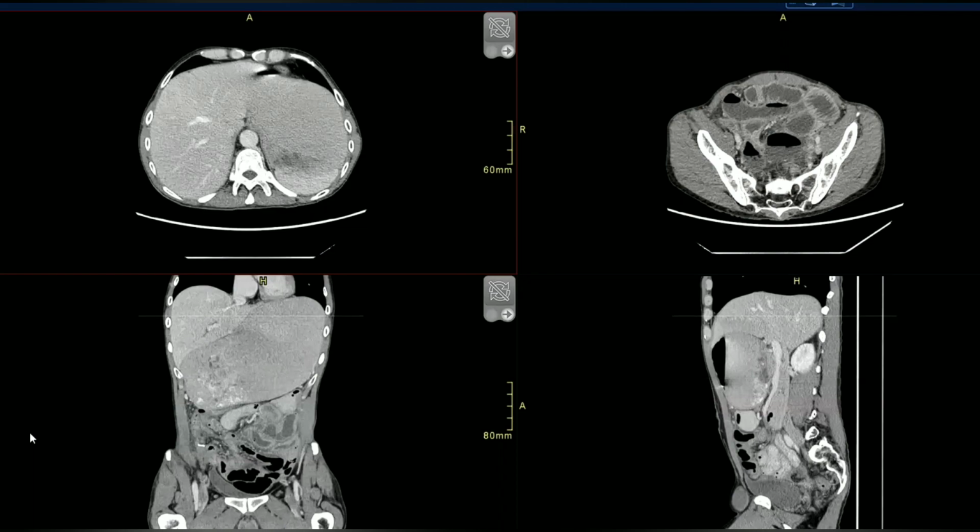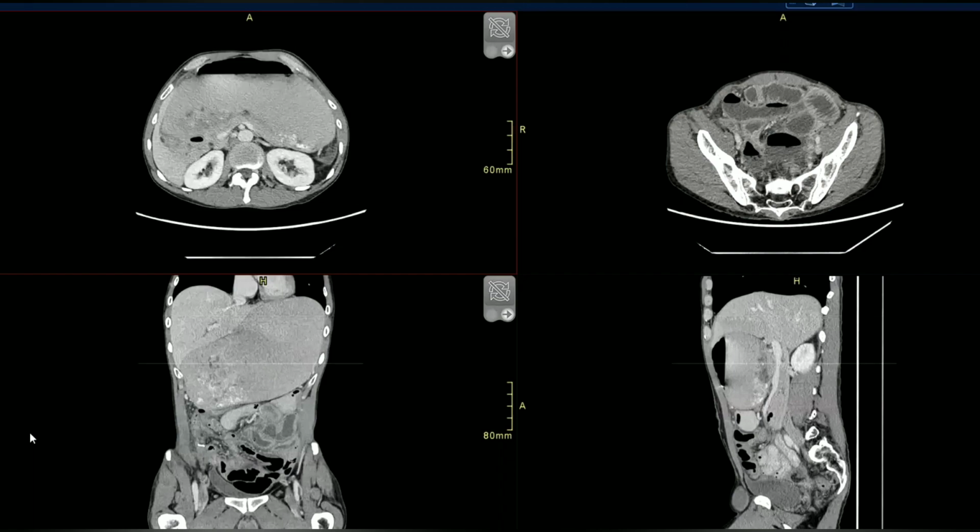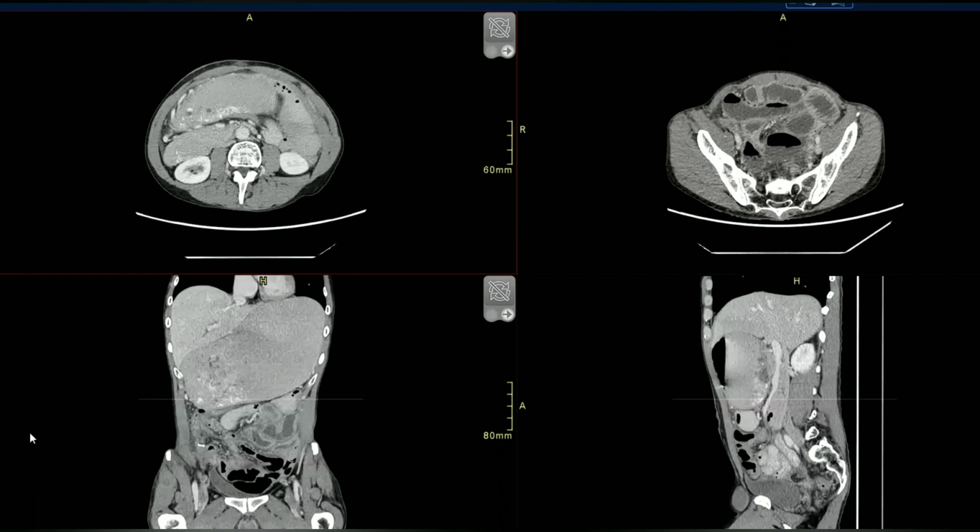Okay, and I would like to see... The pancreas is probably okay, but we don't see it well because the stomach is so much distended. Everything is really not exactly where it should be. So I would leave the pancreas alone.